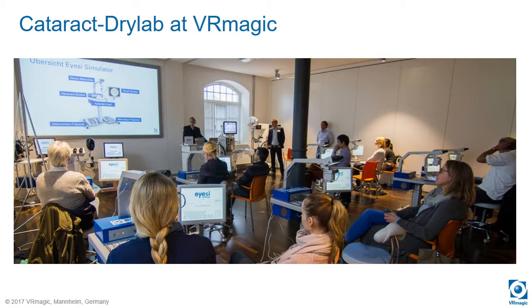The last slide is my favorite situation. That's in our company. That's a cataract lab that we did in cooperation with Alcon, which consisted of, I think, 10 or 12 simulators and one OR machine. The OR machine wasn't used, and the people practiced for 2 days on the simulation. When we started in 2001, this scenario was rather science fiction, and now simulators are applied on a regular basis, either in a large lab or in small setups like in Moorfields, where one simulator sits and all the people are going through this one simulator.